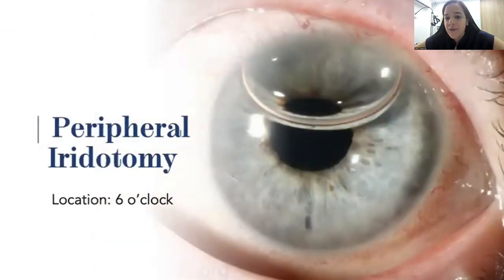Also very important is to do the peripheral iridotomy, since it serves as a preventive measure against pupillary block, allowing the air and the gas bubble to equilibrate between the two chambers. The recommended location is inferiorly, at 6 o'clock, as you can see on the picture, because this prevents the air or gas bubble from obstructing the PI, since gas naturally rises up. So if you do it superiorly, it will be obstructed. If you go inferiorly, when the gas or air goes up, you will have your PI patent.